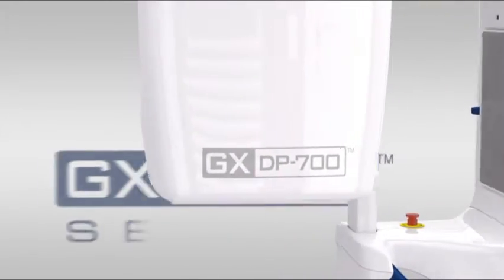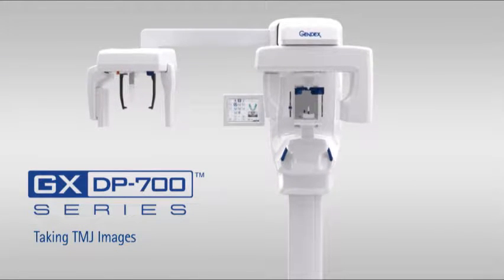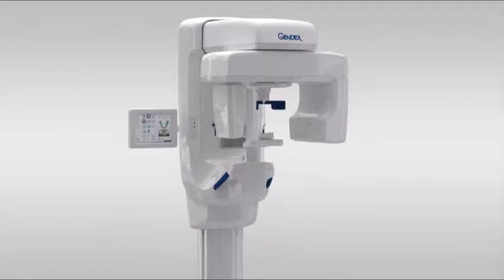Welcome to the GXDP700 training video on positioning for acquiring optimum TMJ images. It's important to familiarize yourself with the various parts of the system.